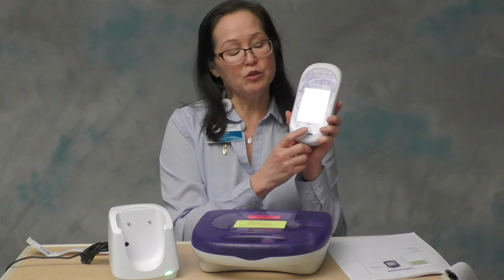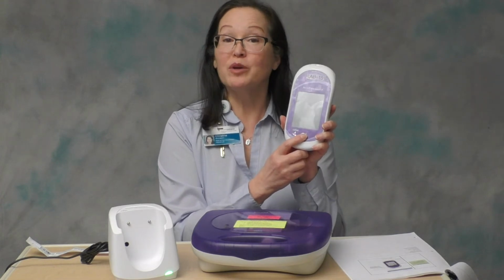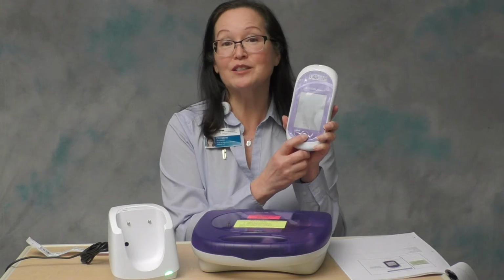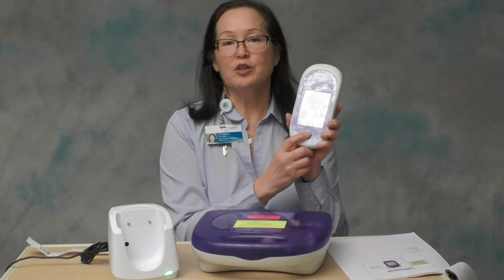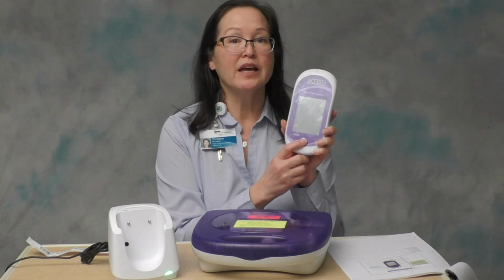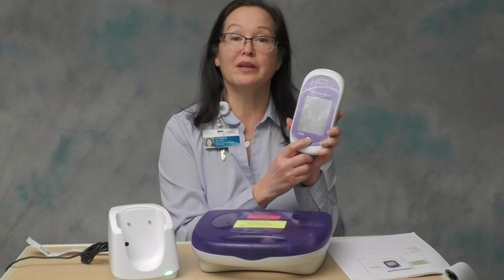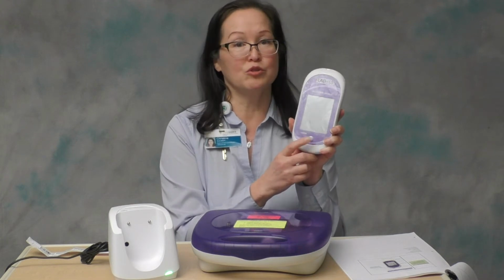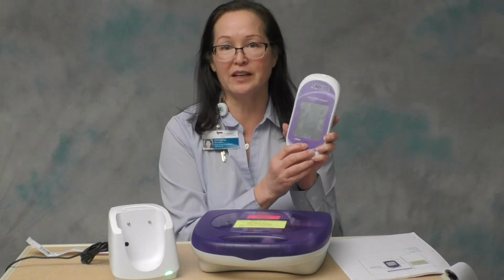To reset the meter, you press and hold the on-off button for 20 seconds. And I always recommend 20 seconds by the clock. I've held it down for 17 seconds before and it has not reset. Once you start to press and hold this button, you will hear a beep at approximately 5 to 6 seconds. That beep just indicates that it is putting the meter into a sleep mode. It does not indicate that the meter has been reset, so don't let go of the button when you hear the beep. Keep holding it down for a full 20 seconds.